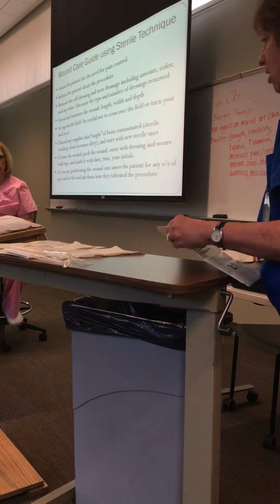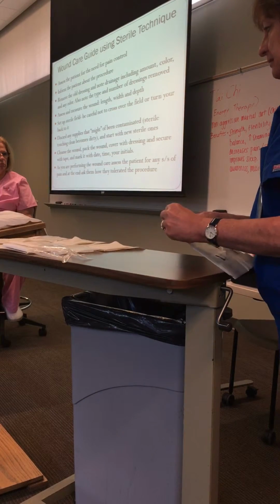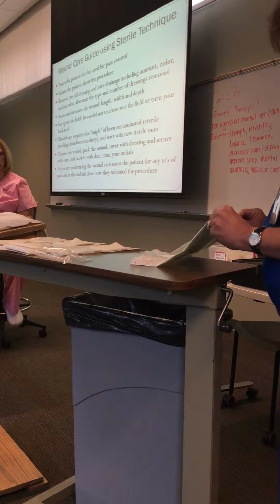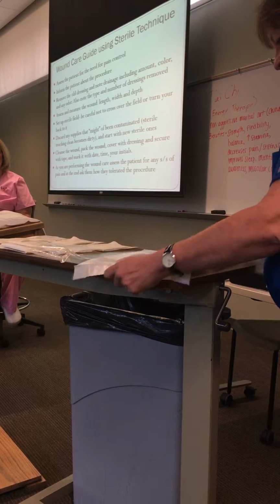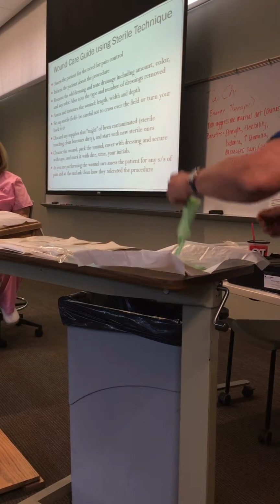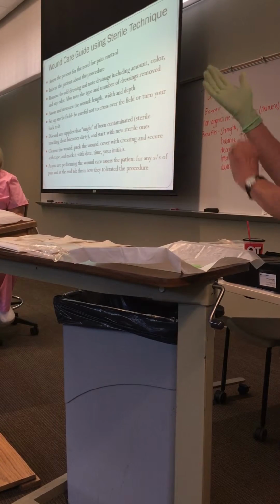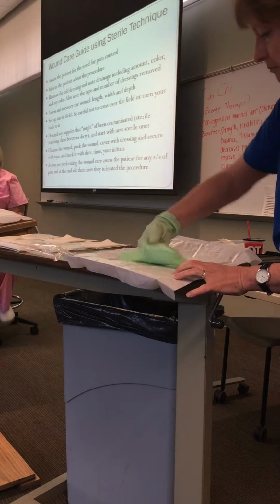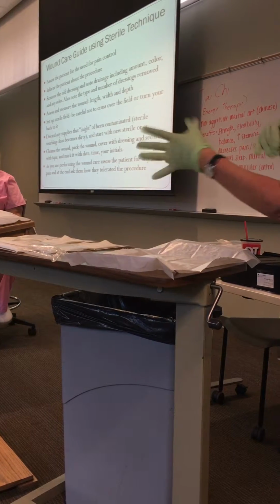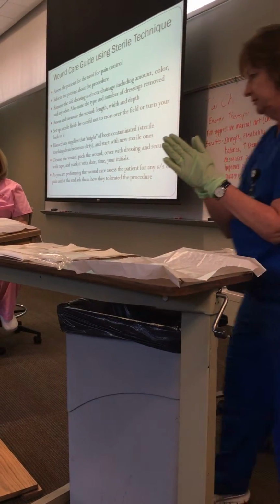Now, I've got to make sure I'm all ready to go before I put these sterile gloves on, right? I shouldn't have to open up any other packages or anything like that. Gloves. I can fix. Okay, so now I'm sterile.